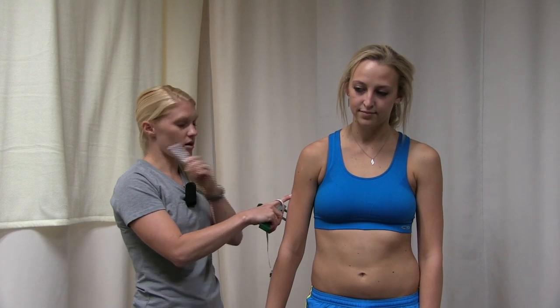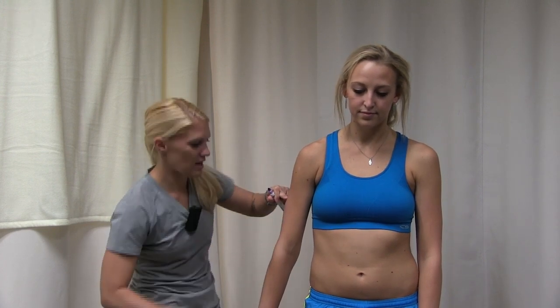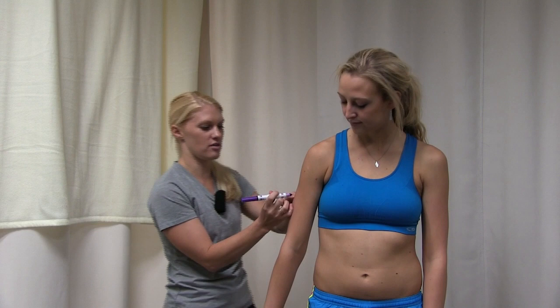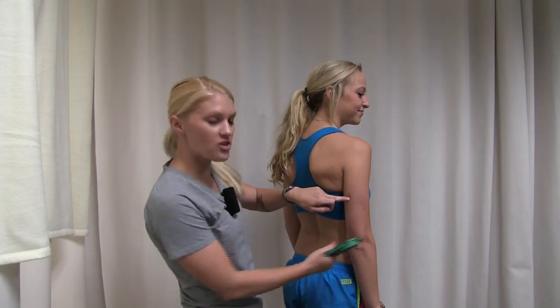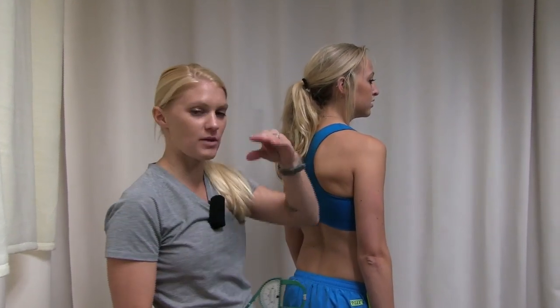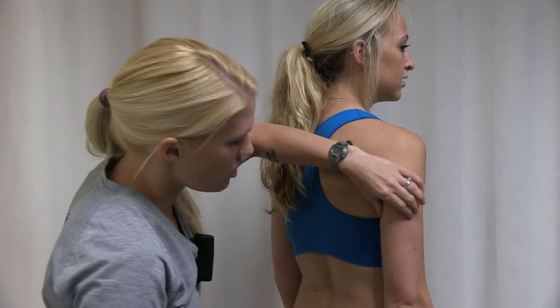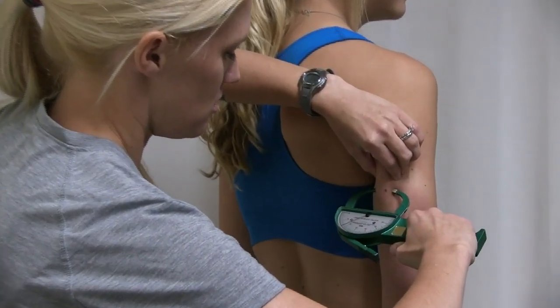We're right at 16. It helps to make a mark on the body so you don't have to measure again. I take that halfway point, mark it, and transfer it to the back of the arm — the actual tricep. Now we measure right where we put that mark. I grab the skinfold with two fingers above the mark so the caliper lands on the mark itself, separating out the subcutaneous fat from the muscle. We got 17.